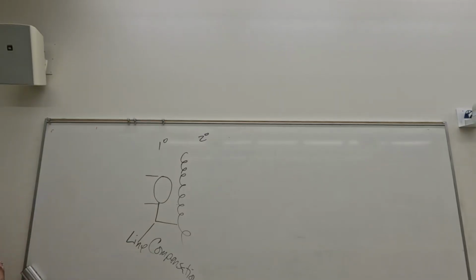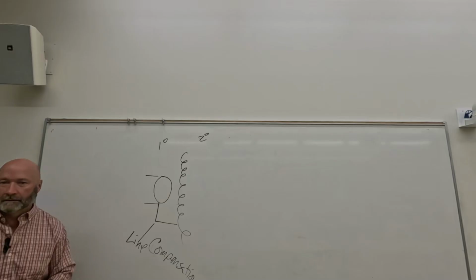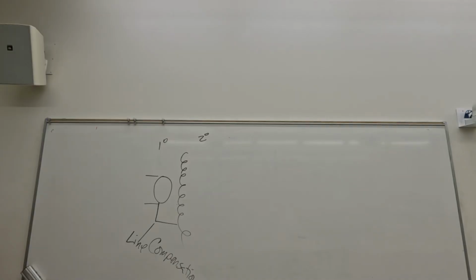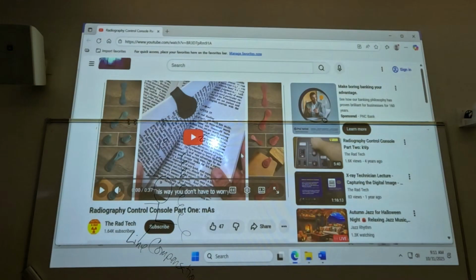If you look at your control panel, where do you see this? You don't, right. The only time you're ever going to see this is if you happen to work somewhere with a single phase machine. I'm not going to drop the screens, but I am going to turn on the display. I don't think I'm going to drop the screens unless I absolutely have to.